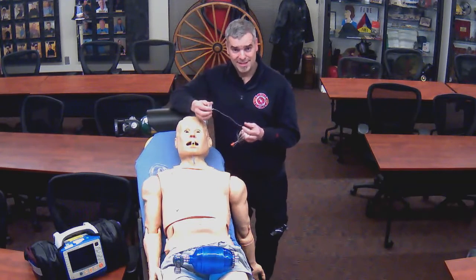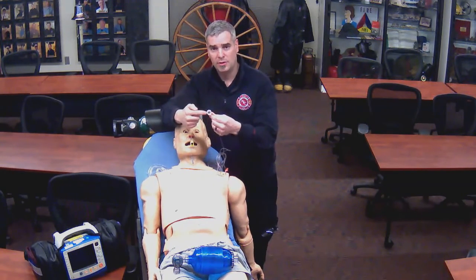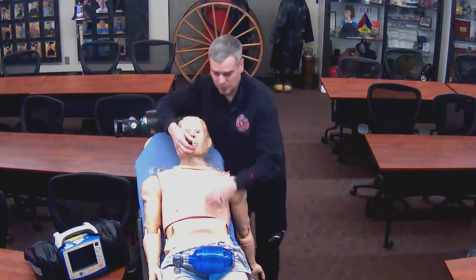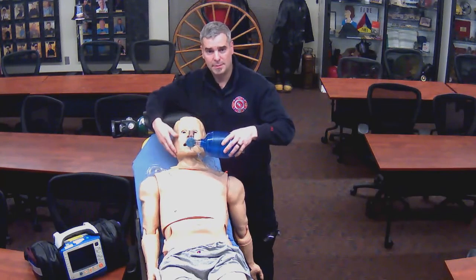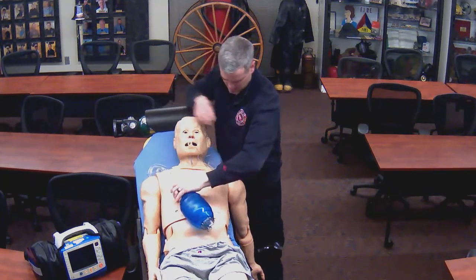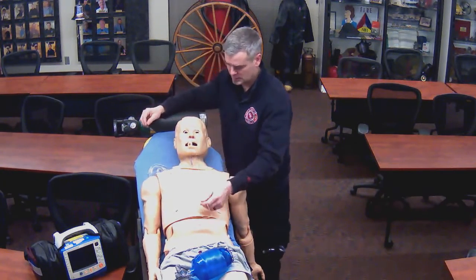So for monitoring ETCO2, we have an advanced airway in for this inline type. The inline type has a large and a small port. The larger port fits over the King tube or the ET tube. The smaller side we utilize for the BVM. So we're just going to bag the patient just like we normally would every 5 to 6 seconds during a code. And the other portion has that quarter turn or half turn luer lock that goes into the side of the monitor. Just as simple as that.